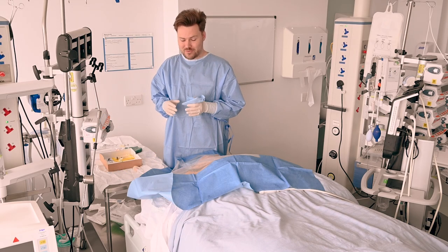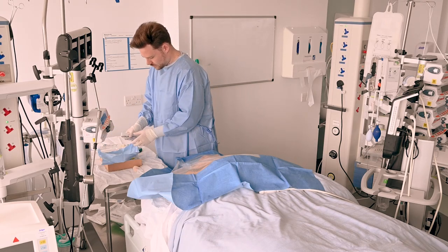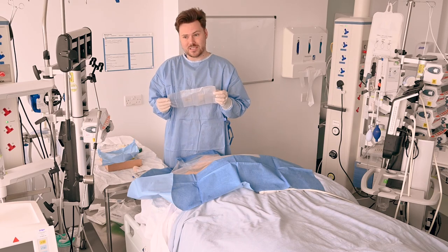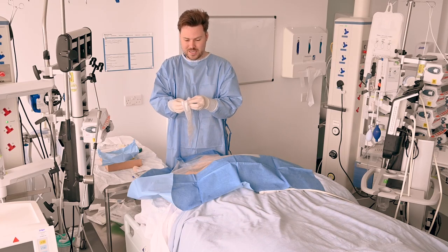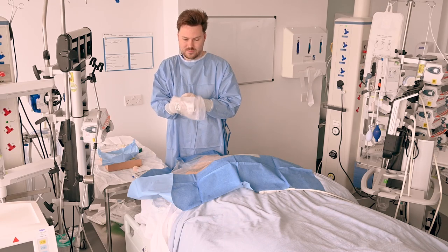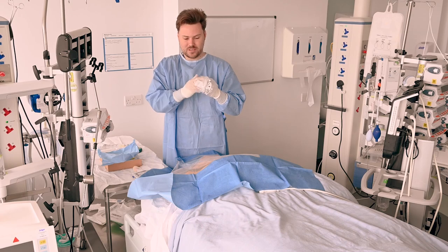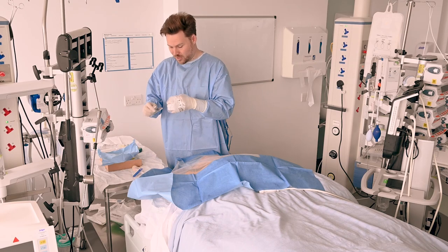Now that my line is flushed and ready I'm going to pick up my ultrasound probe. Inside the pack there's some ultrasound jelly, the drape itself, some rubber bands and some tape. To use the drape most effectively, what I find is best is to part it at the closed end, opening each layer in turn until you get to the centre. Put your hand through to make sure you're in the right place and then grab it with your other hand. You can then push this back through to let you pick up the probe and also put a small amount of jelly at the end of the probe cover bag.